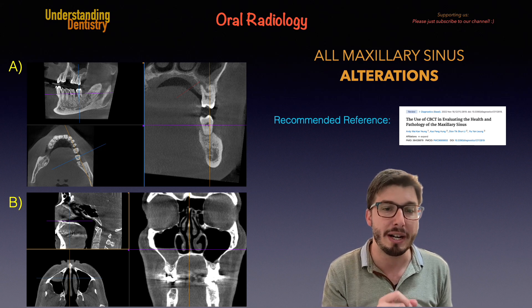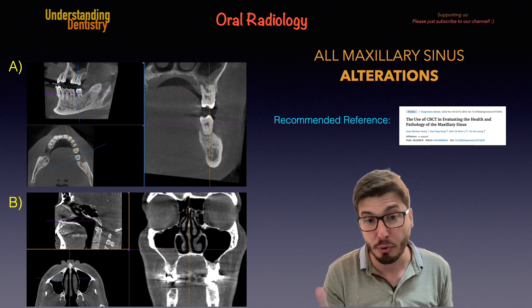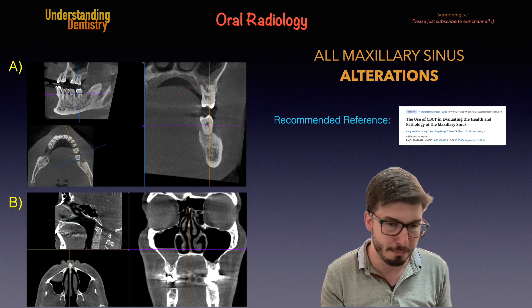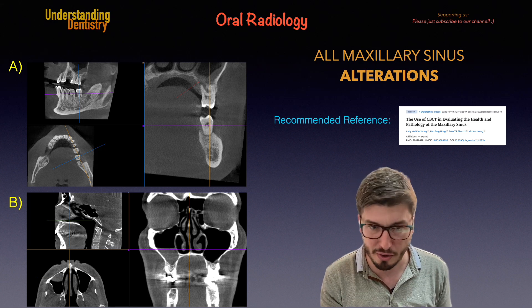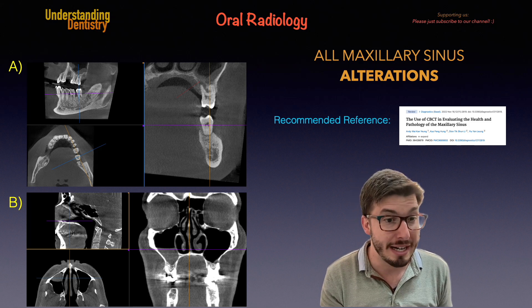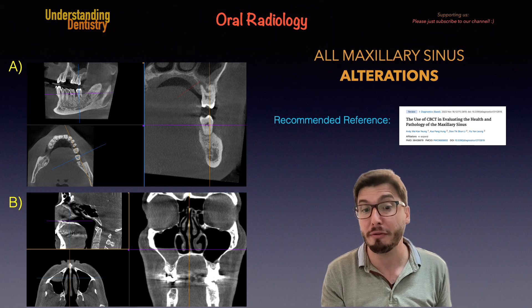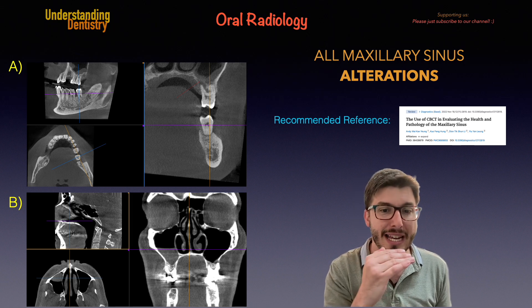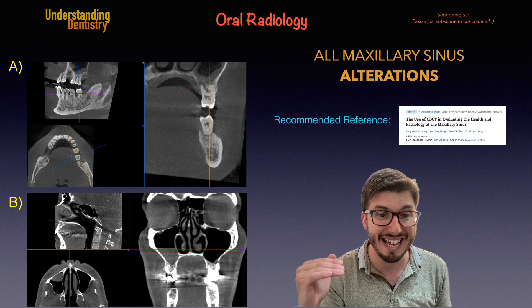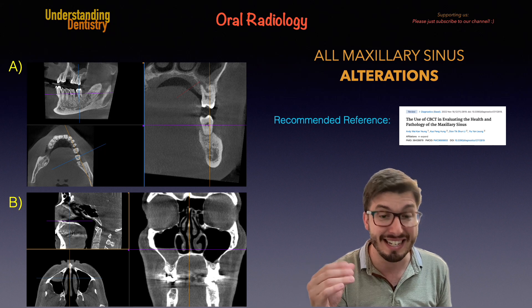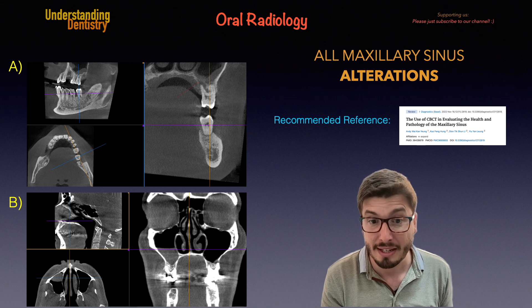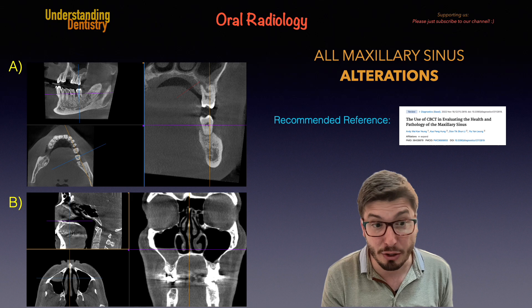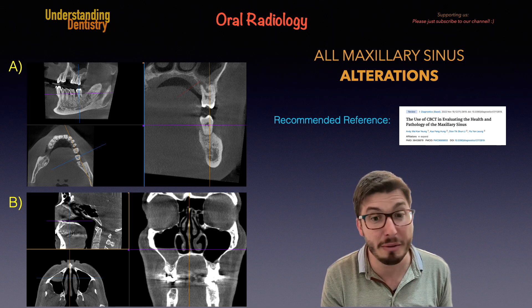Those are examples of sinus opacification. Most of the sinus alterations will be sinus opacifications. Now on the letter B we have a different type of sinus opacification. The line of the opacification is now flat, showing that that's liquid — so that's usually acute infection on the sinus. The alteration is on the left side of your screen, which is the right side of the patient.